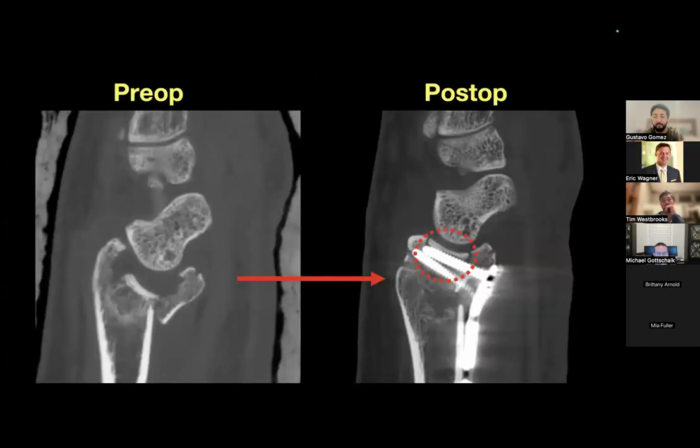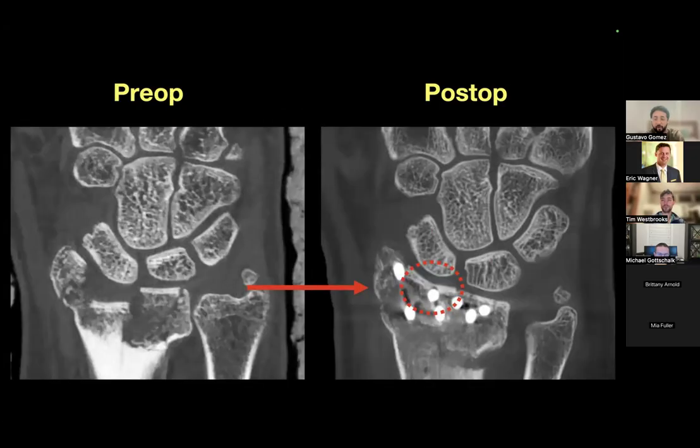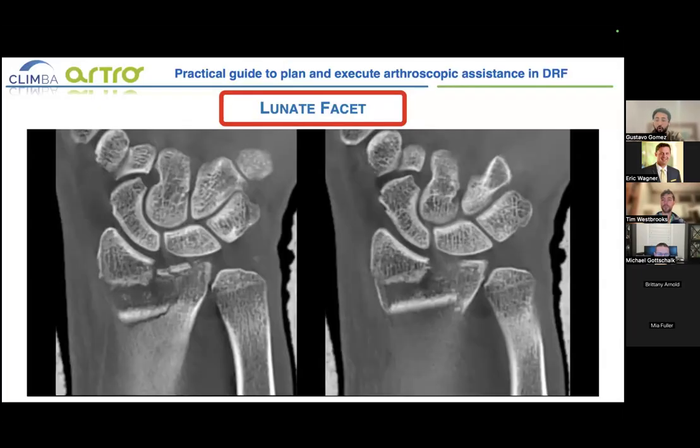And then we go to definitive distal fixation. You can see here the CT scan in sagittal view. I always like to check the position of the fragment and the screw with this CT scan. The screw always has to be placed below the fragment to avoid collapse of the fragment after the surgery. I want to repeat this again because for me it's very important. As you can see here at the right of the screen, we can see the same in coronal view.